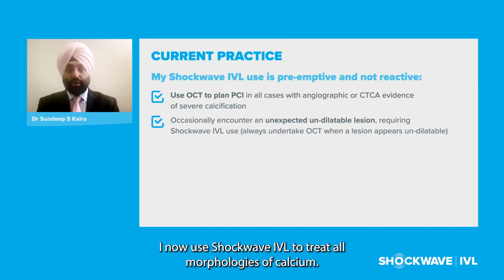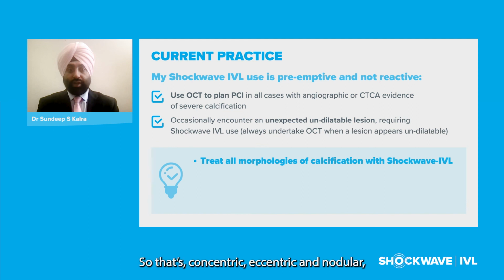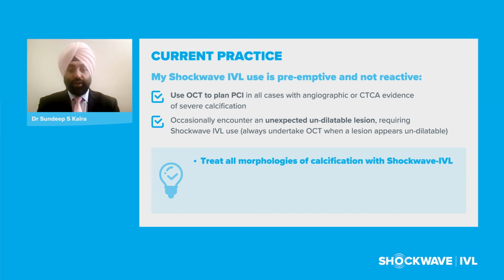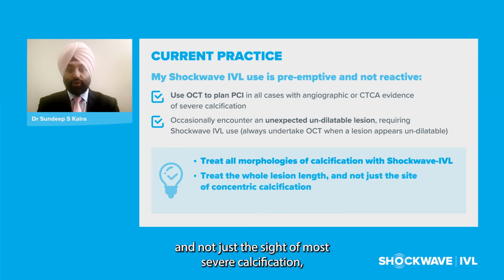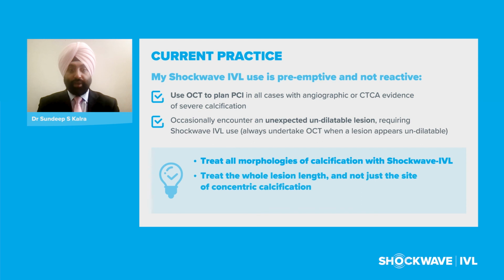I now use shockwave IVL to treat all morphologies of calcium, so that's concentric, eccentric, and nodular, and not just the original indication, which was concentric calcification. I treat the whole lesion length and not just the site of most severe calcification, which we were traditionally using for areas of concentric calcium.